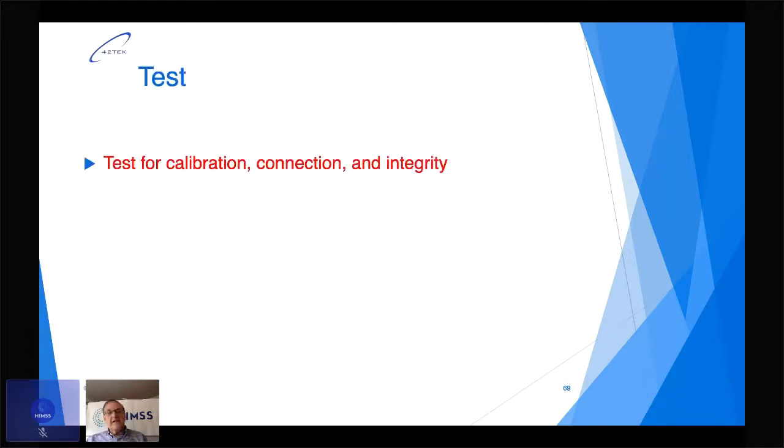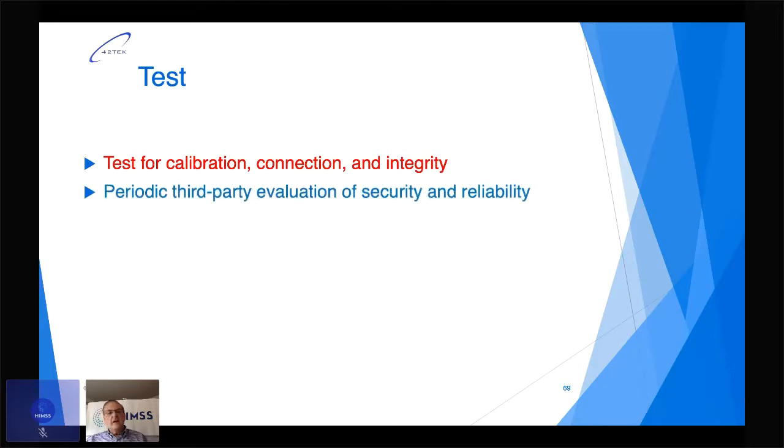And these devices need to be tested. And really, we should have outside parties take a look at that, because you quite often can't recognize your own mistakes. And so that's why we have vulnerability scans and penetration tests on these kinds of systems. And it will be very interesting to think about doing that on a system of systems, or whether it needs to be done individually.